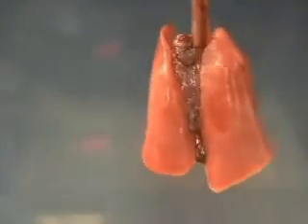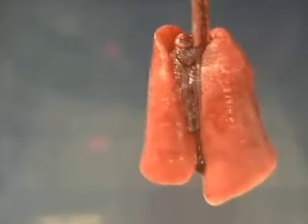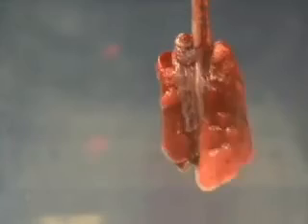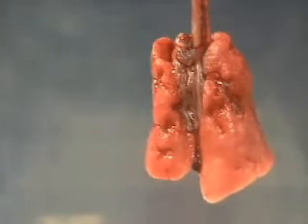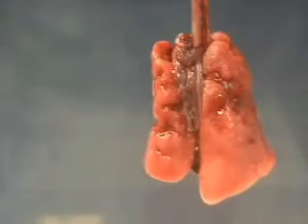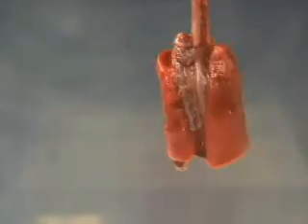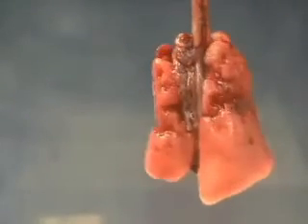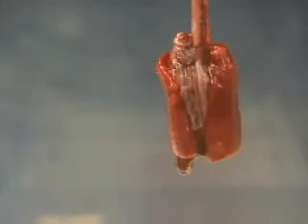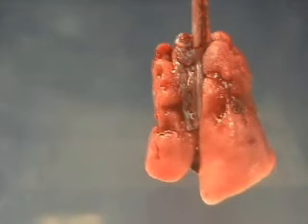The PEEP level is now decreased to 0. The first inflation looks relatively homogeneous, with no major areas of atelectasis. On the second inflation, large areas of heterogeneity and atelectasis appear at the end of inspiration. With each breath, there is collapse of the lung and then re-expansion of some areas, but again, there are some areas that remain collapsed throughout the breath.